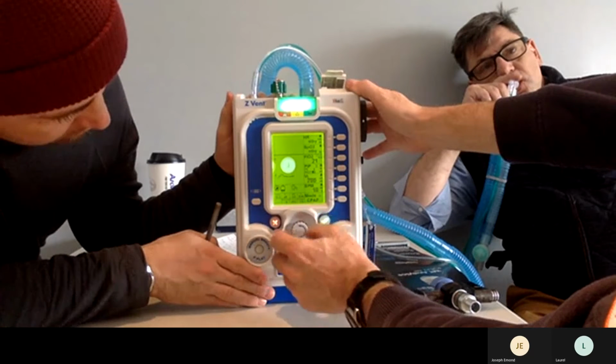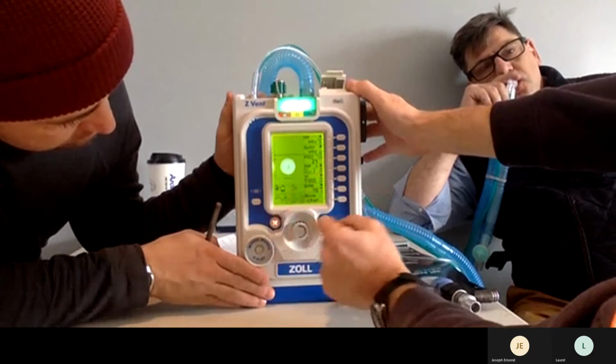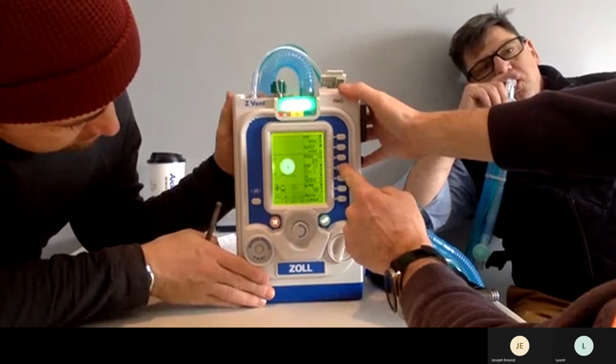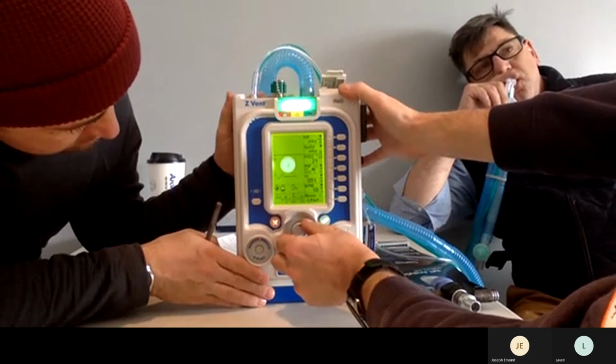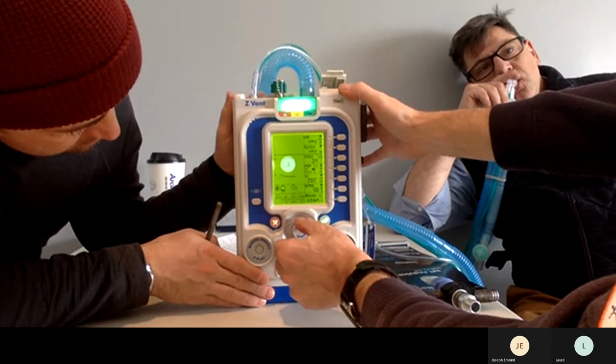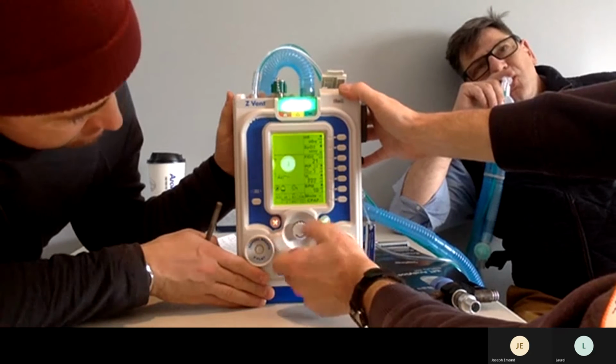What are you turning up right now? Here's the dial. Gotcha, acknowledge. Yep, I did. Now he said slowly go up to 4 on pressure support. 2, 3, 4. Acknowledge.